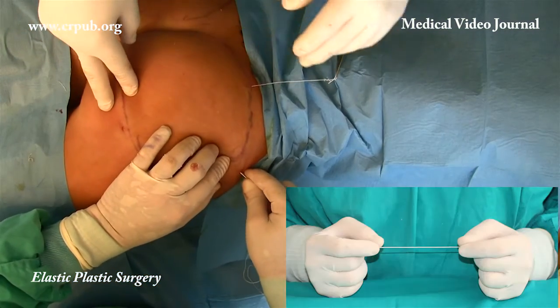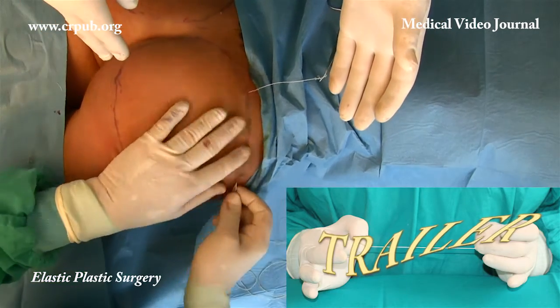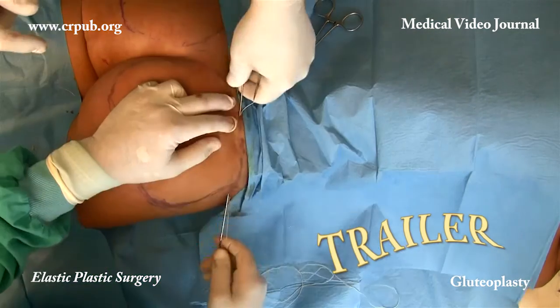Elastic lifting is indicated to correct the drooping and loss of shape of the buttocks. Even if the volumes of the buttocks are modest, compacting yields a pleasing result.